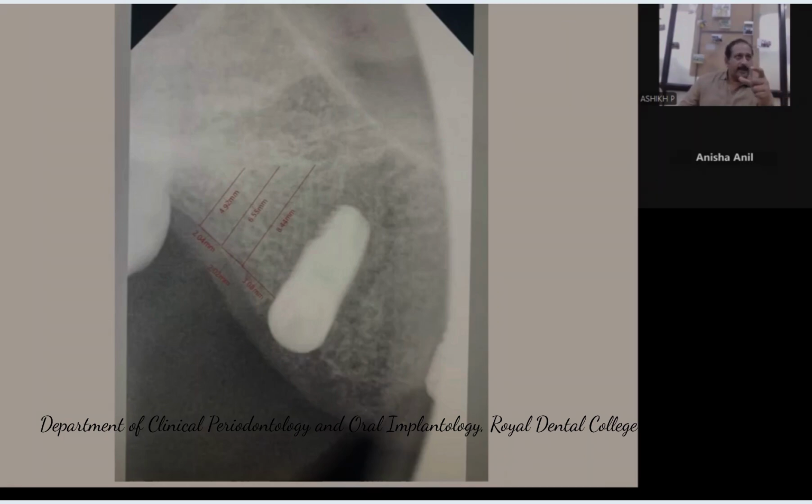So, if you need to consider a 4 millimeter implant or with some amount of a sinus lift, still you would search for a possibility of wider diameter. Yes. So we have got 4 millimeters possible here with the length, with the span. So if 4 millimeter is possible with the width also, then fine. This is a reasonably good size for a molar area. So anything beyond 3.3 is to be utilized here.